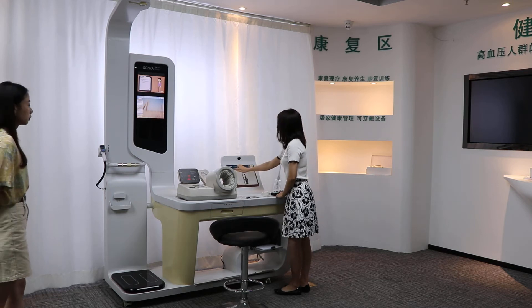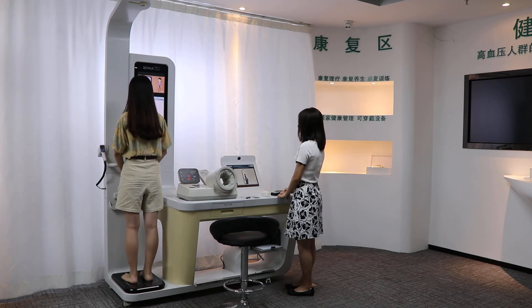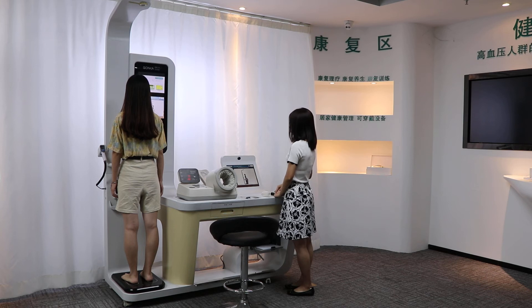Okay, measurement starts. The person stands on the platform. First, it measures height, weight, and BMI.